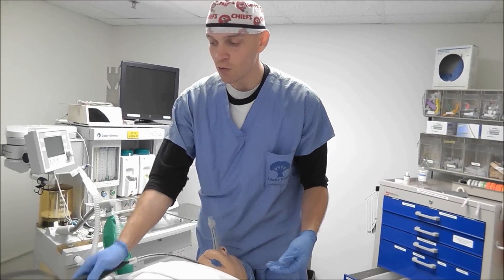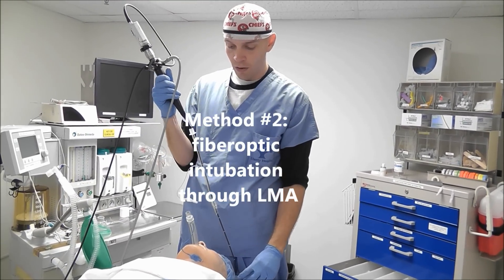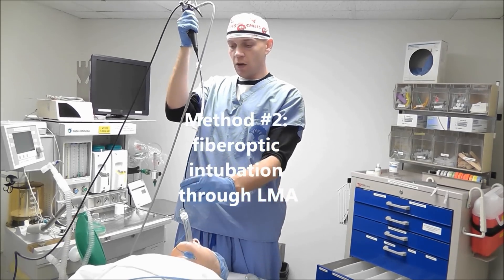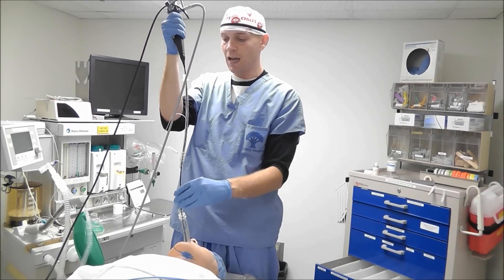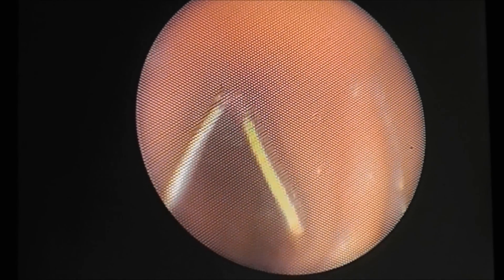The next option is use of a fiber optic bronchoscope. We get our endotracheal tube ready like this, and then we go ahead and pass the scope down the LMA and guide the tube into the trachea. I just advance this scope down the LMA until I see the vocal cords there, and I'll just pass this scope through the cords.